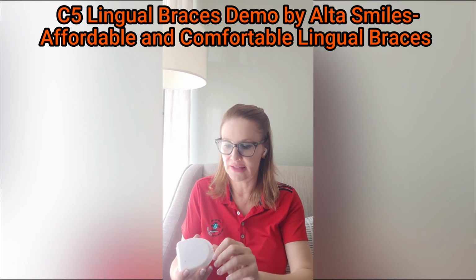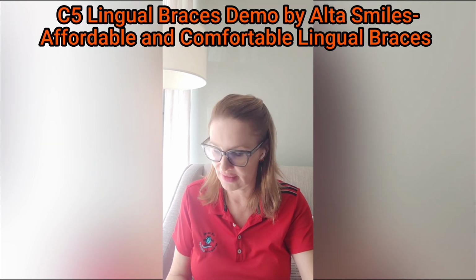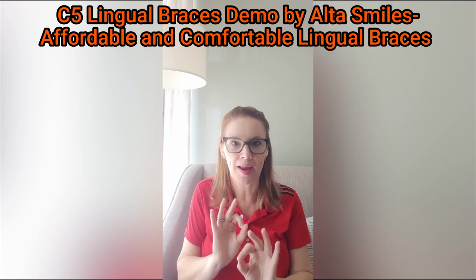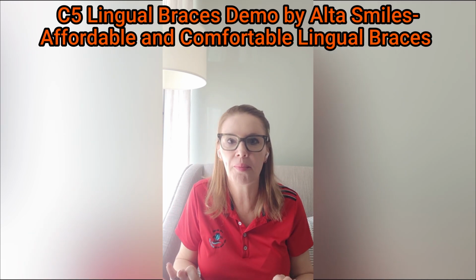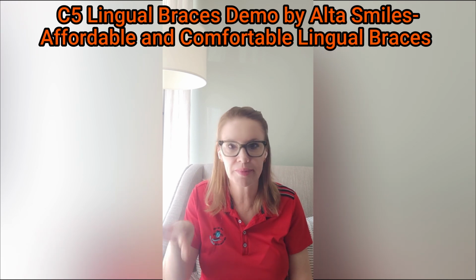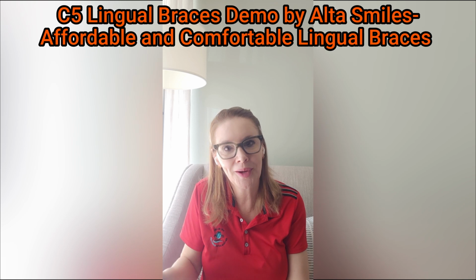But yeah, if you like to do bonded retainers, y'all are nuts if you're doing these, unless you're really savvy at doing these in-house, because unless you put them on perfectly passively, the teeth will move. So it's really great to have an indirect bonded tray that's already stabilized, slap it on, bond, done. And yeah, you can order these from any ortho lab, but this price point was cheaper than what we've been paying.